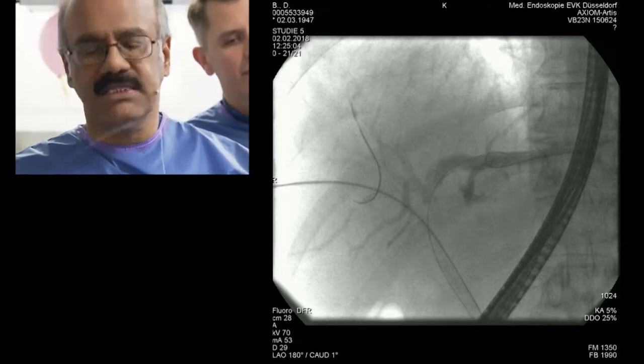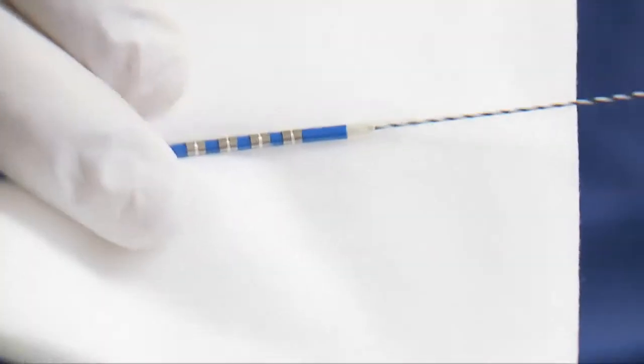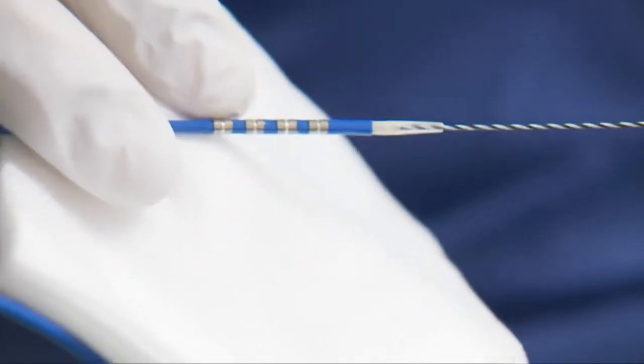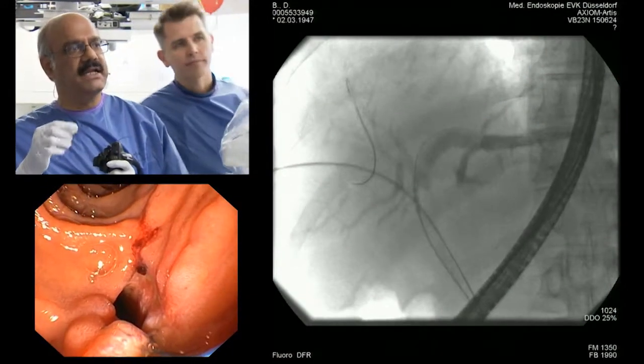The first thing we are going to do in this case is a radiofrequency RFA ablation of the strictures — we have to do it on both sides, left and right. There are four electrodes here spaced three millimeters apart. It is a bipolar catheter; the current goes from one to another, creating bipolar thermal energy. We have placed these four rings at the stricture in the left hepatic duct.